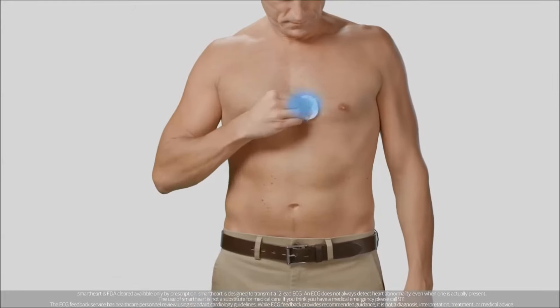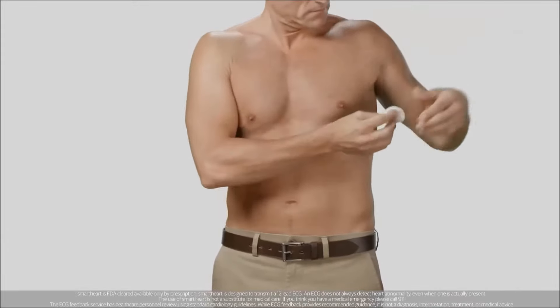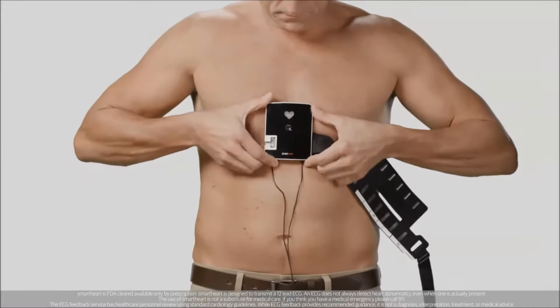Start by using a wet cloth to dampen the body parts that will come in contact with the electrodes. Next, place the SmartHeart device at the center of your chest.